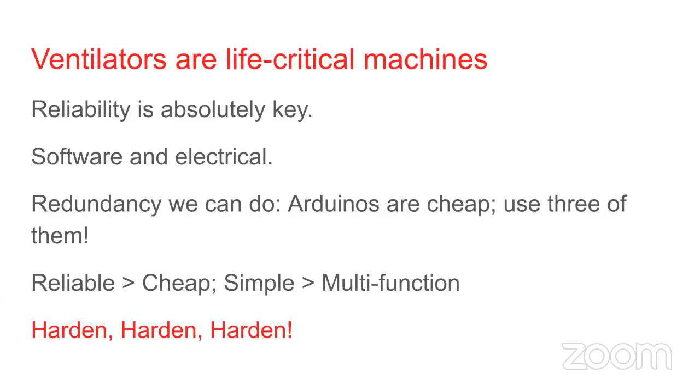So finally, ventilators are life-critical machines. Reliability is absolutely key, and that means both software and electrical. I believe the way that we can address this is through redundancy. Arduinos are cheap. There's no reason not to use three of them if it's going to make your machine more reliable. So unlike my perception of the Arduino hobby universe, which has made cheap and flexible multifunction things, this domain requires a different mindset. And believe it, it's hard for me because I'm mostly a computer programmer.